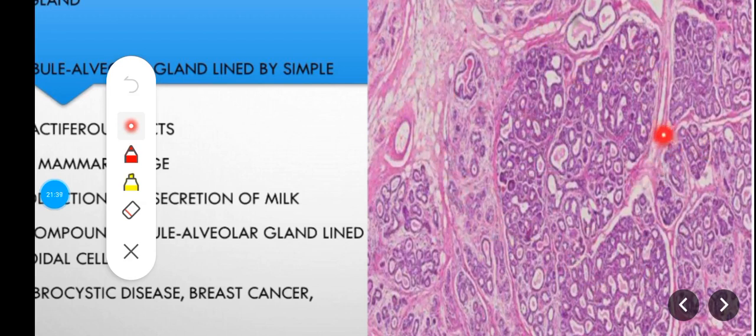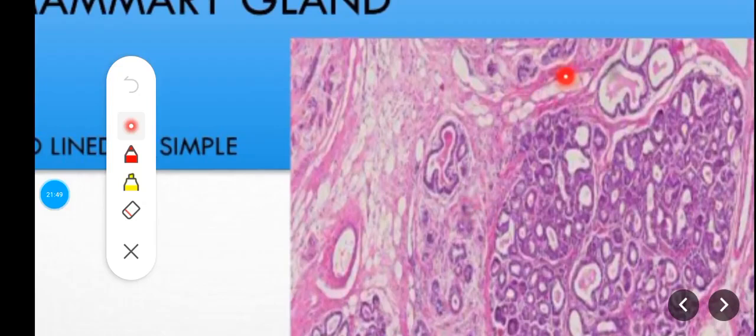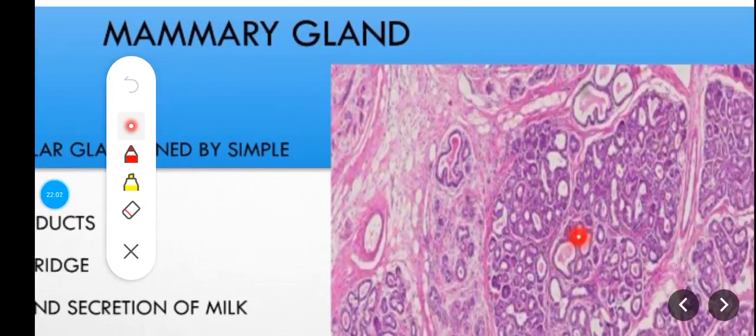So this is the fibrofatty stroma. These white spaces that don't stain well, these white circles, look like vacuolated cells; they are the adipocytes. So they are numerous. Also, within the alveoli, you'll appreciate a lumen. So this is the alveoli; these circles within the lobules represent the alveoli.